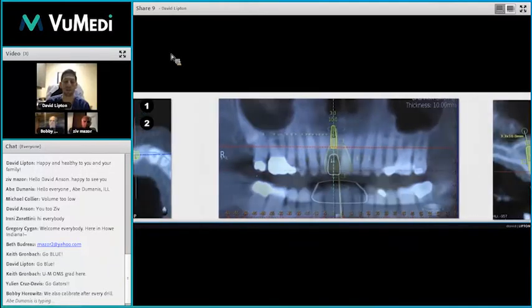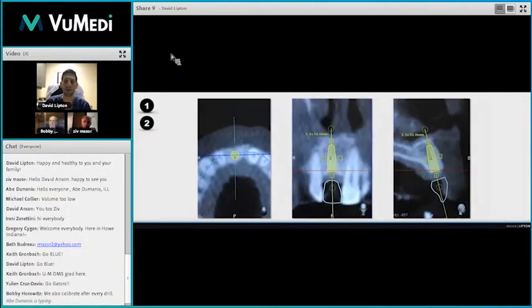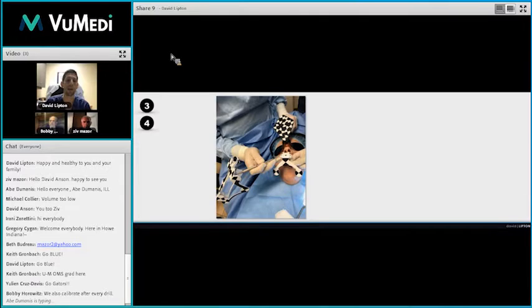And utilizing all the views, we were able to guide and place our implant through the 3D software to the ideal prosthetic location that we felt comfortable with the restorative doctor. The patient's now brought in and prepped and draped, head tracker applied, and now we're calibrating our tracer tool.